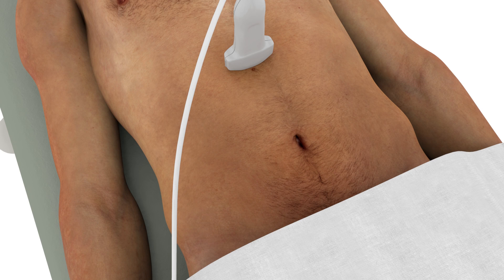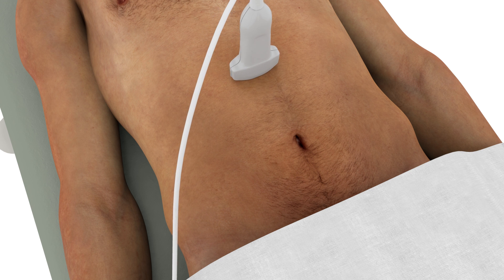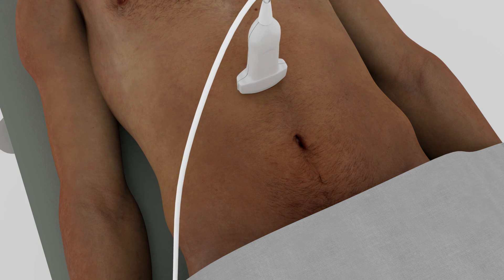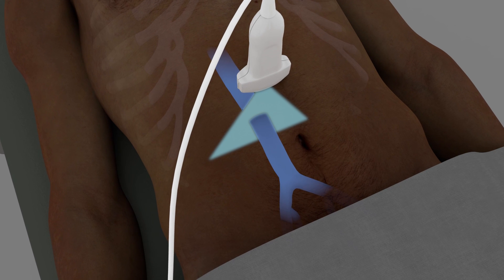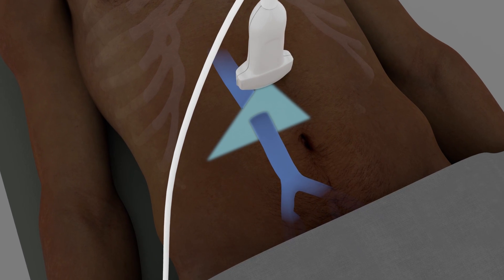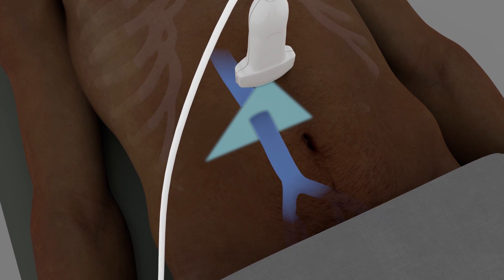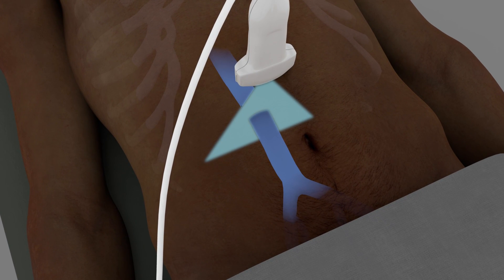To obtain a transverse view of the IVC, place the probe on the midline halfway between the xiphoid process and the umbilicus. The probe marker should be pointing toward the patient's right side. Adjust the gain and depth to obtain the best possible image.